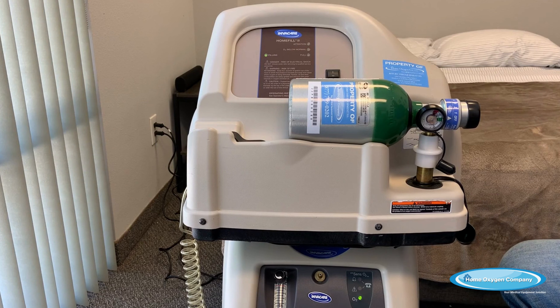The home fill system makes you self-sufficient for your oxygen needs. So in the event of a power outage or if you're evacuated, all you need to do is simply unplug this machine.